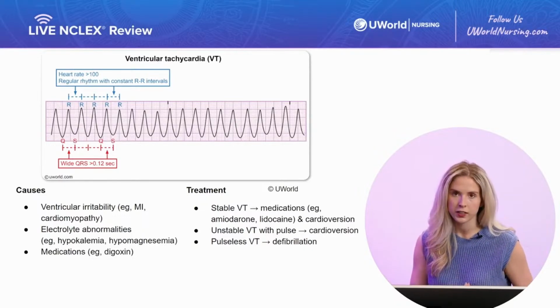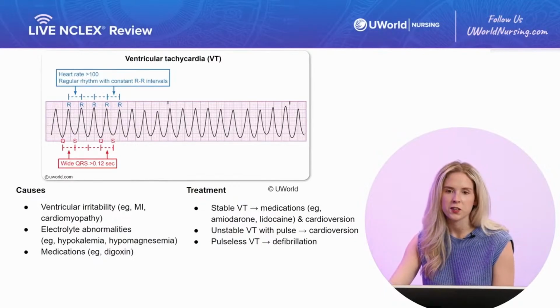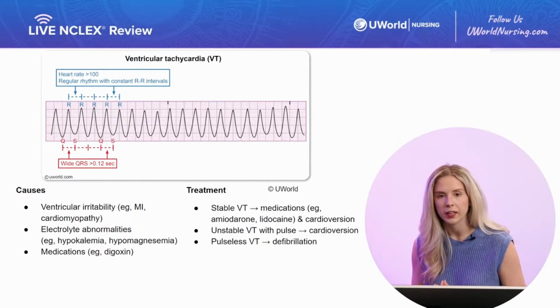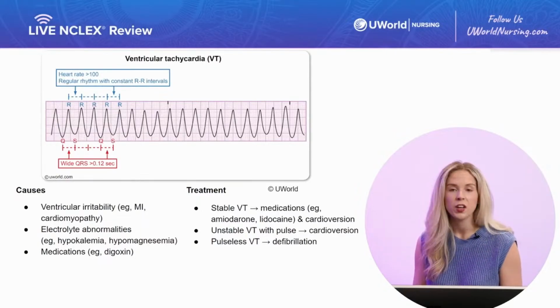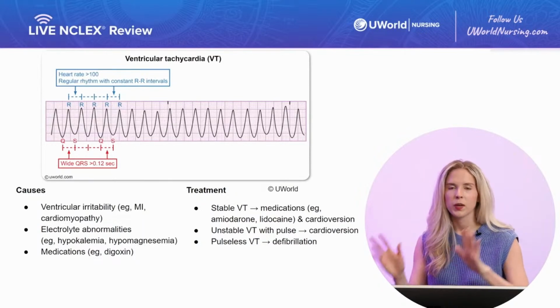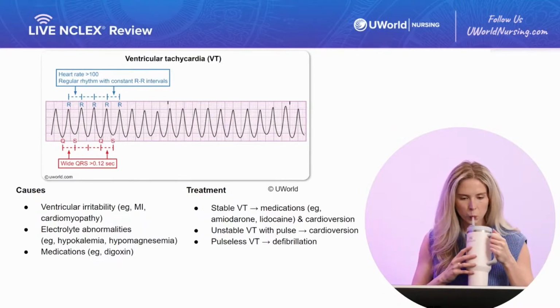Now, cardioversion is performed with a defibrillator, but there's one key difference between cardioversion and defibrillation. And I'm going to ask you guys what this is. So what button must be engaged on the defibrillator when you cardiovert? Bonus points if you guys can share why, but what is one button you have to make sure is engaged to make sure you are not defibrillating, we are cardioverting? And if you don't know it, no worries, but if you do, drop it in the chat, let us know.